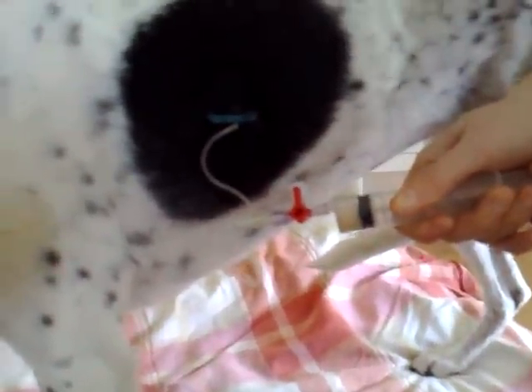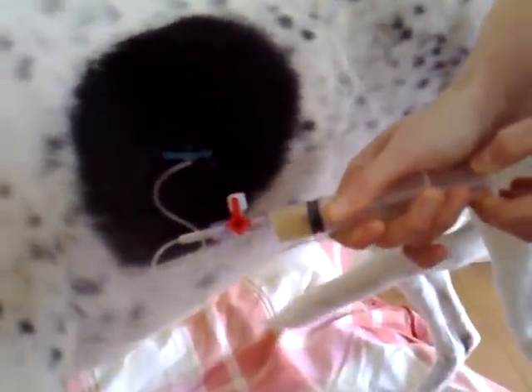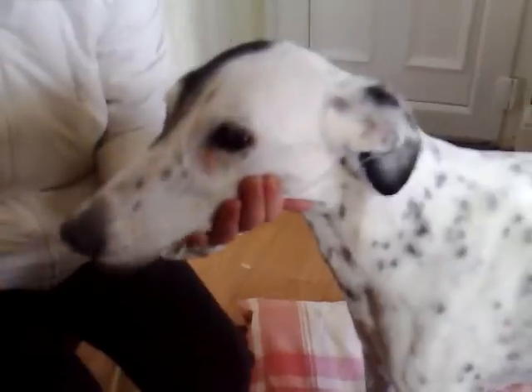This procedure can be repeated until you no longer get any fluid. As you can see, this procedure is not causing any distress to the dog.